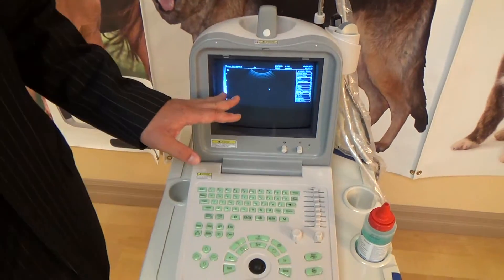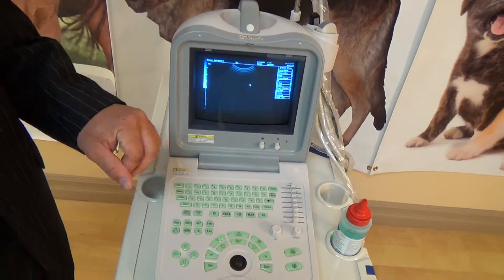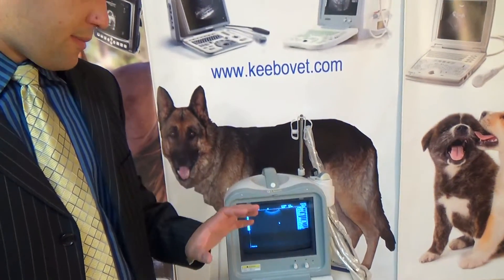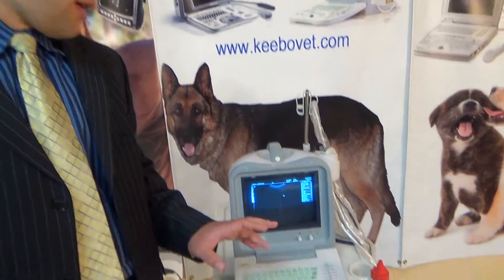Focus basically helps you obtain better image quality. If you have a lot of focus points, that sometimes slows the machine down in terms of frame rate because the computer is putting together a better image.